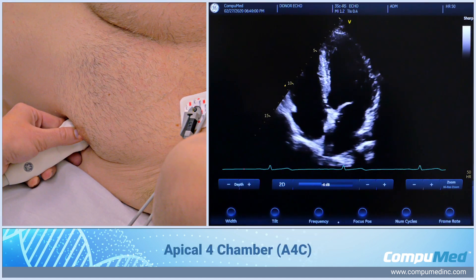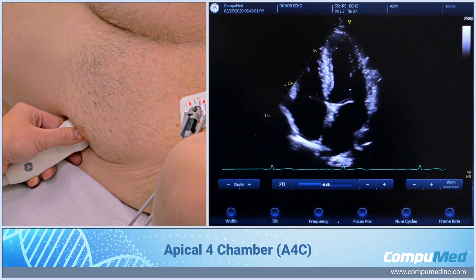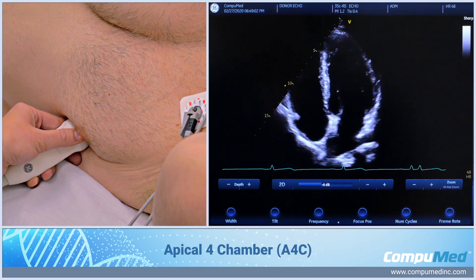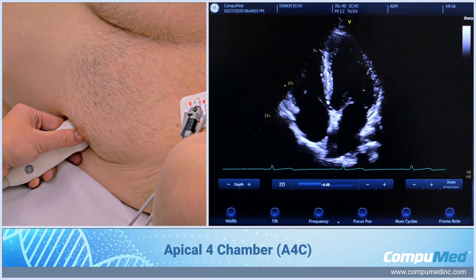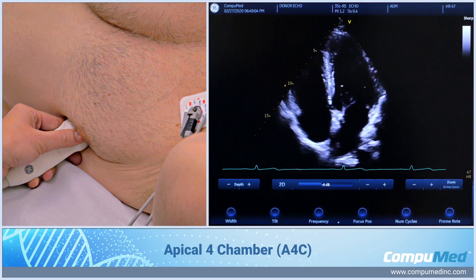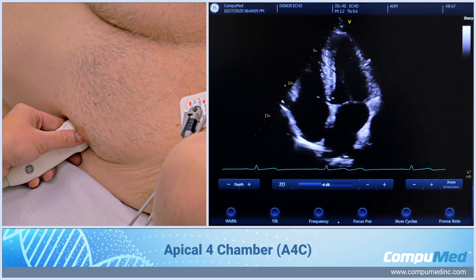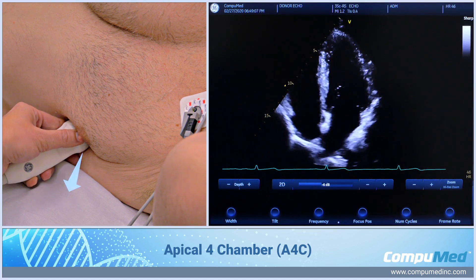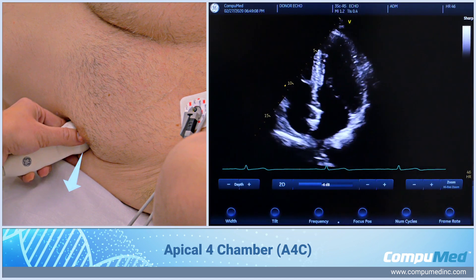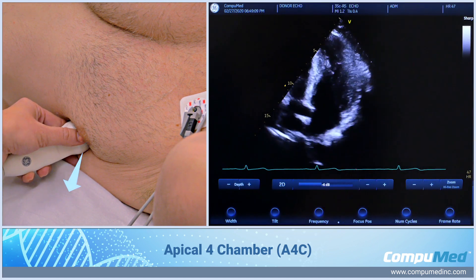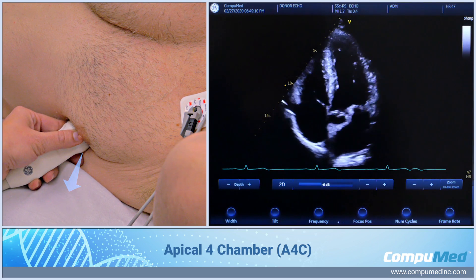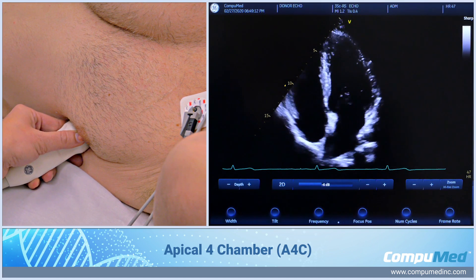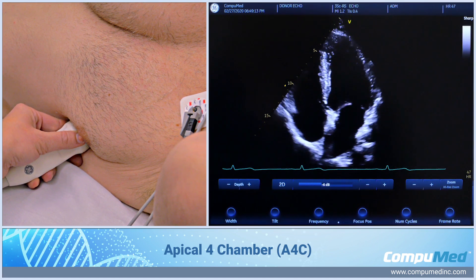For our apical 4-chamber view, we're going to go to the patient's left side underneath the left breast. My index marker is at 3 o'clock facing towards the bed. Here we have an overall 4-chamber.